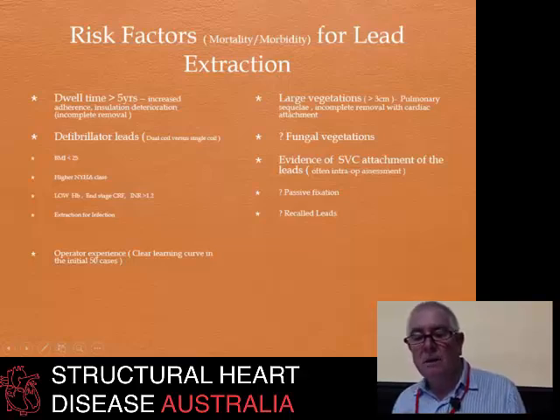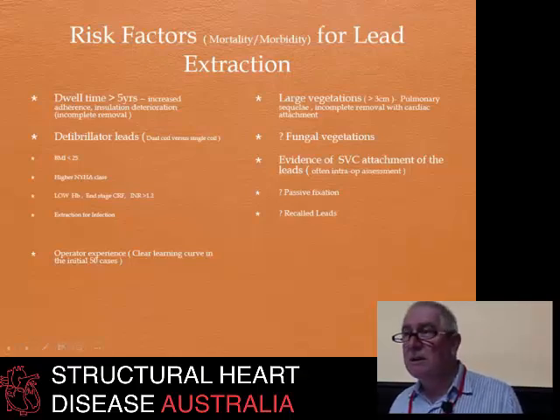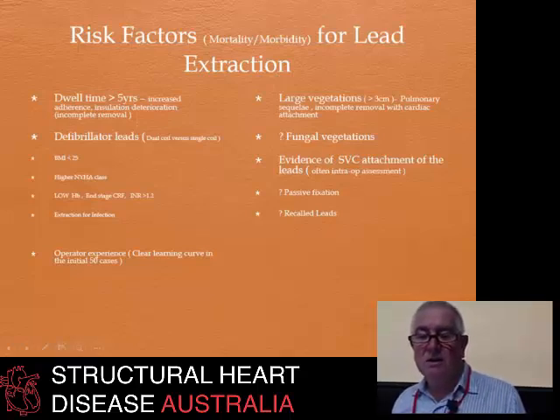So we took it out. The vegetation was still largely stuck to the wall of the SVC, and while we're trying to deal with the bleeding from our cannulation extraction site, the vegetation embolized and occluded the main pulmonary artery. So I've got a bit of respect for large vegetations.